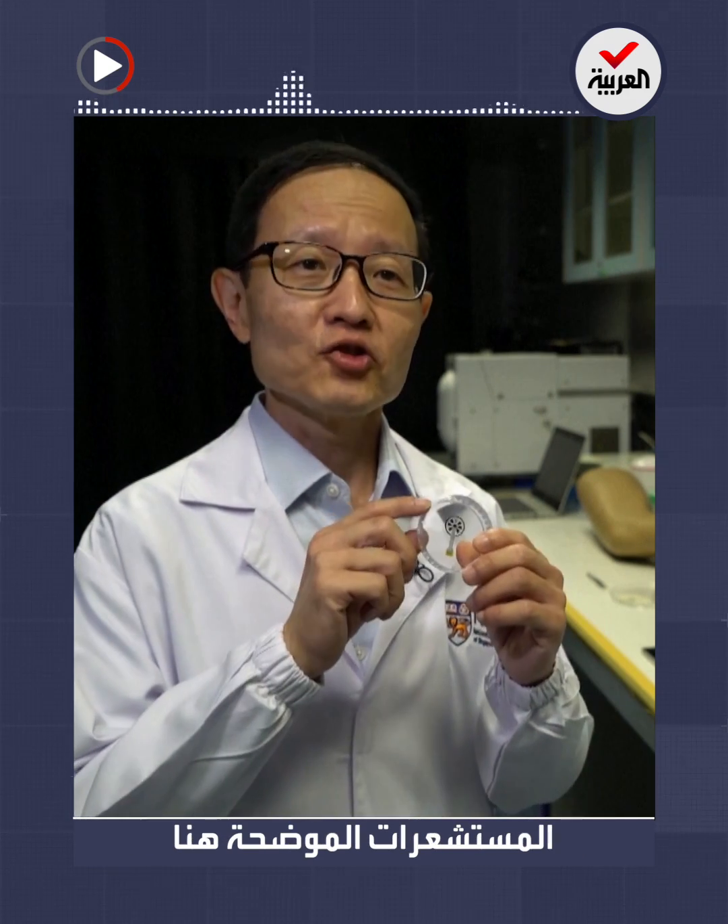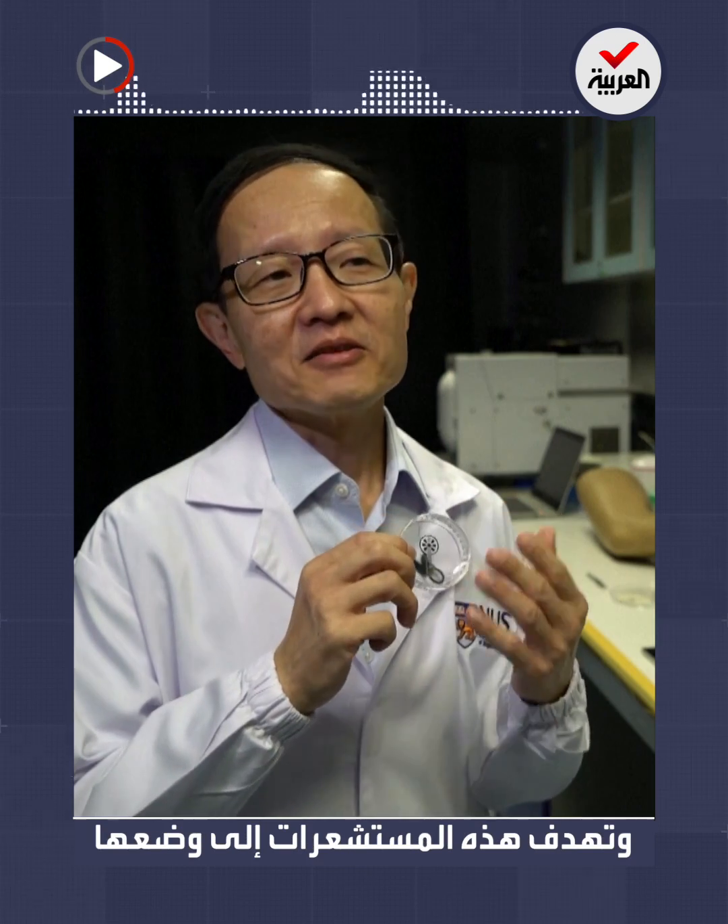So, this is what we call a smart bandage. Basically, this bandage consists of a number of sensors that are shown over here. These sensors are meant to be placed onto the wound to be able to detect a number of biomarkers from the wound fluid. Compared to an ordinary bandage, the ordinary bandage doesn't have such a sensor placed on them.